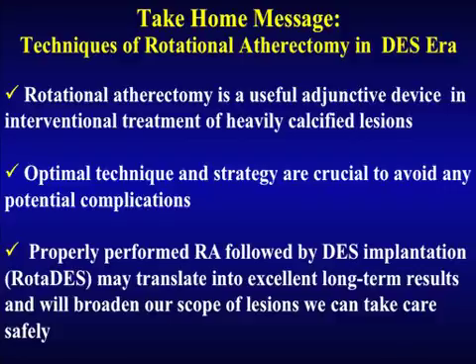Second, of course, the optimal technique and strategy are crucial to avoid any potential complications, and the issue always remains: are we doing well in using rotational atherectomy in the long segment and then implanting the DES just in the area which you post dilate? It means after rota, whatever length you dilated with a balloon should be covered by the DES, not the entire area of the rotational atherectomy.